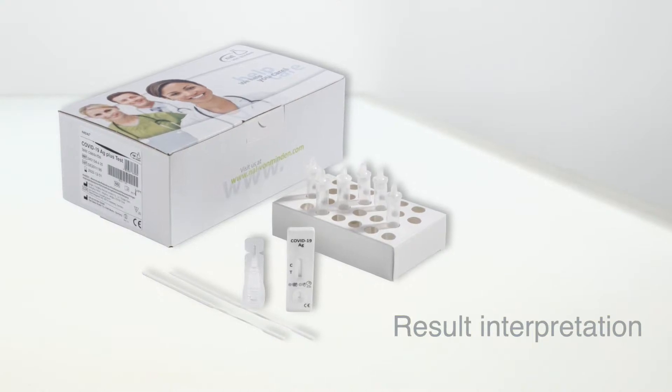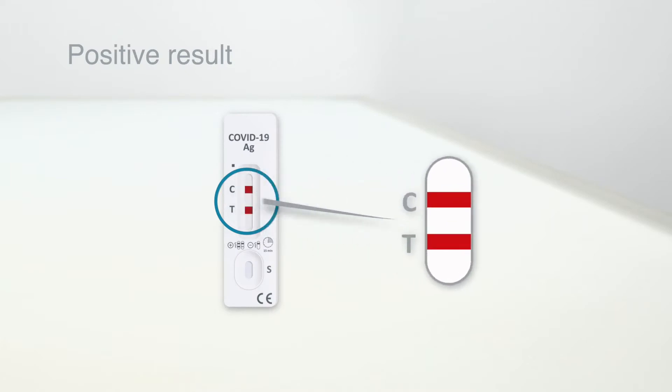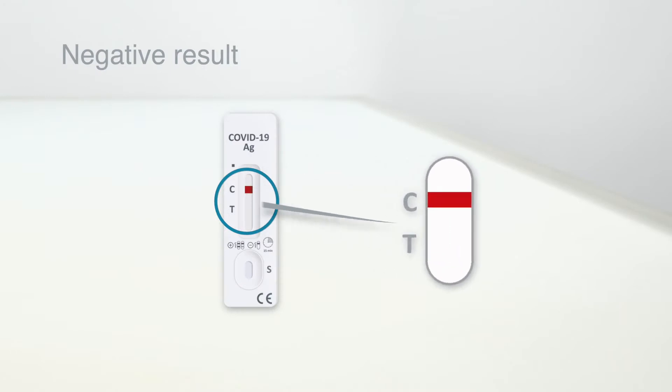Read the results. Two lines — one in the control line region and another in the test line region — indicate a positive result. If only the control line appears and not the test line, the result is negative.